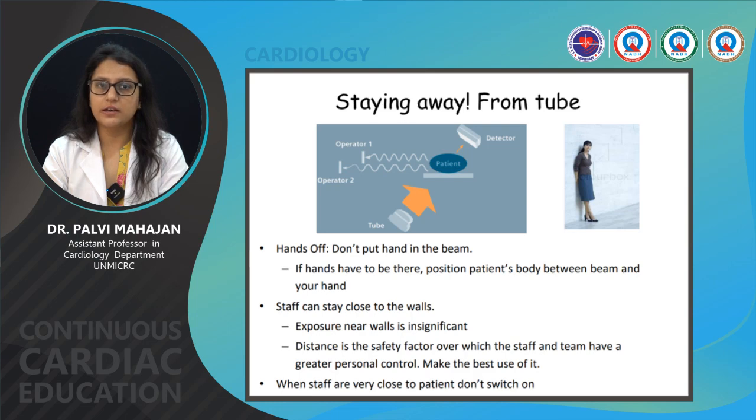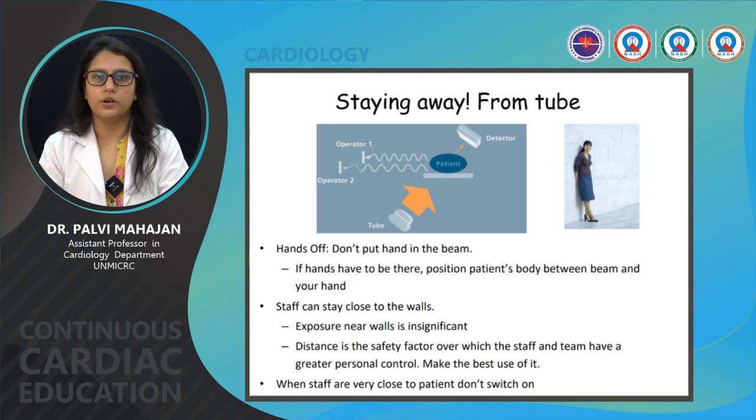Staff can stay close to the walls. Exposure near the walls is insignificant. Distance is the safety factor over which the staff and the team have a greater personal control. When the staff is very close to the patient, don't switch on.